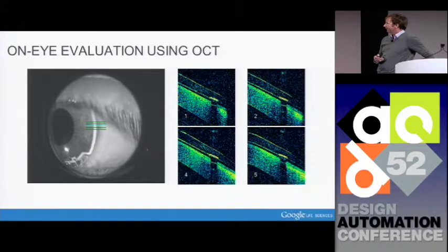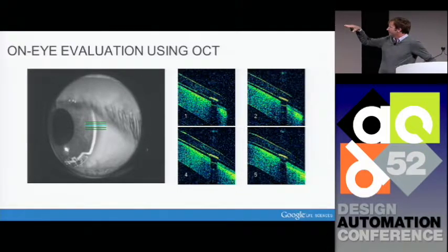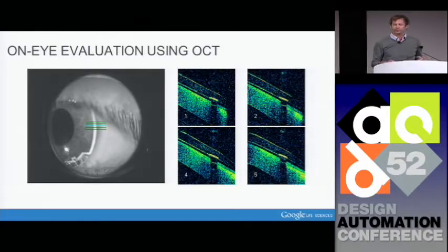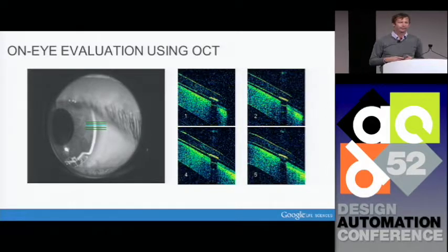This is one type of experiment that we do on eye with this contact lens. This is an optical coherence tomography device. It's standard. You'd see it in an optometrist's office. There's an image on the left, and those little cross-section, the green horizontal cross-section lines are shown on the depth profiles on the right, where we can see the surface of the eye, the cornea, we can see the layers of the contact lens, and we can see the thin bar in the middle, which is the antenna trace around the outside. And this is something we do to assess fit of the contact lens, to verify the internal structure of the contact lens on eye.